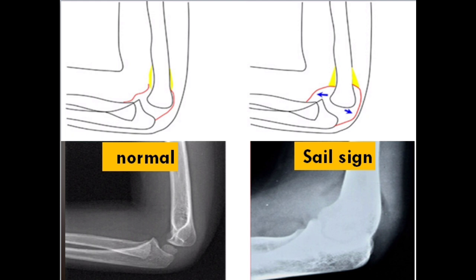It is described as a sail sign because it is unusually prominent and bows outwards to form a triangular shape. After trauma, blood can accumulate in the intra-articular space and push the fat pad anteriorly. A positive sail sign in the setting of trauma is a reliable indication of an intra-articular fracture, even if no fracture line can be identified. An atraumatic sail sign indicates intra-articular fluid of an inflammatory nature.